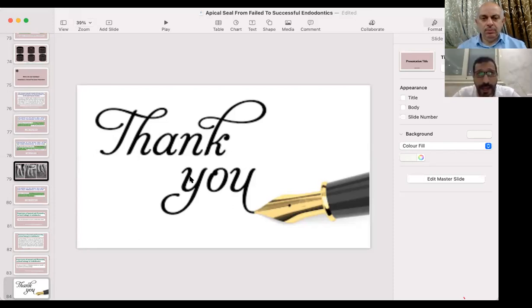That's why I add my voice to your voice. We have to use an electronic apex locator during working length determination in all of our cases because it is mandatory in the literature.